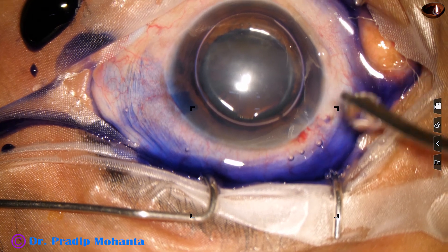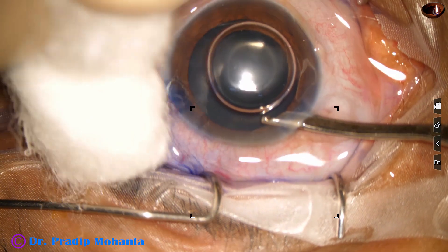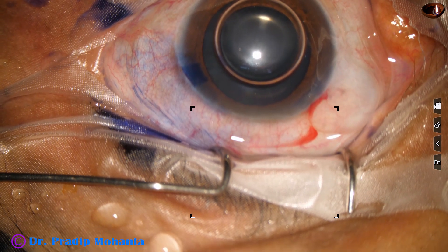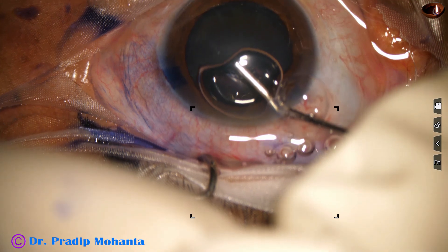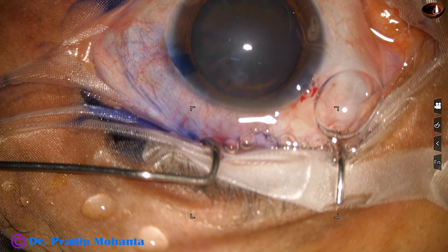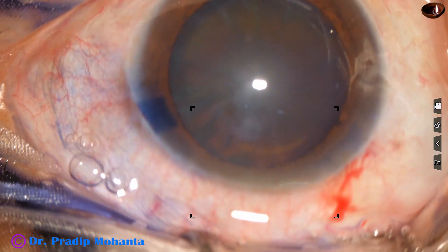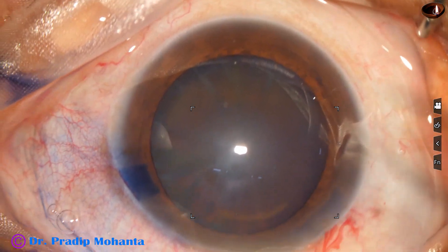This is a bit of adrenaline. The dye is washed out. If we don't wash the dye and instead replace the dye with visco, then in some parts there will be less dye sticking on the iris and that will cause some problem in visibility. So best visibility is achieved if we wash the dye and then inject visco.